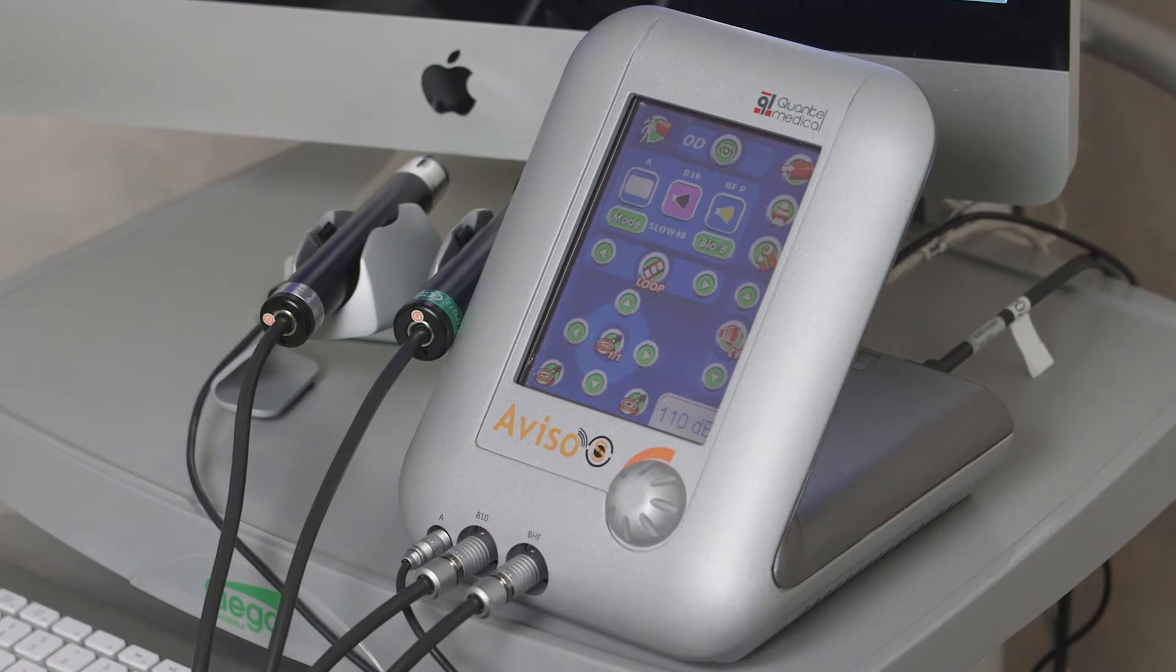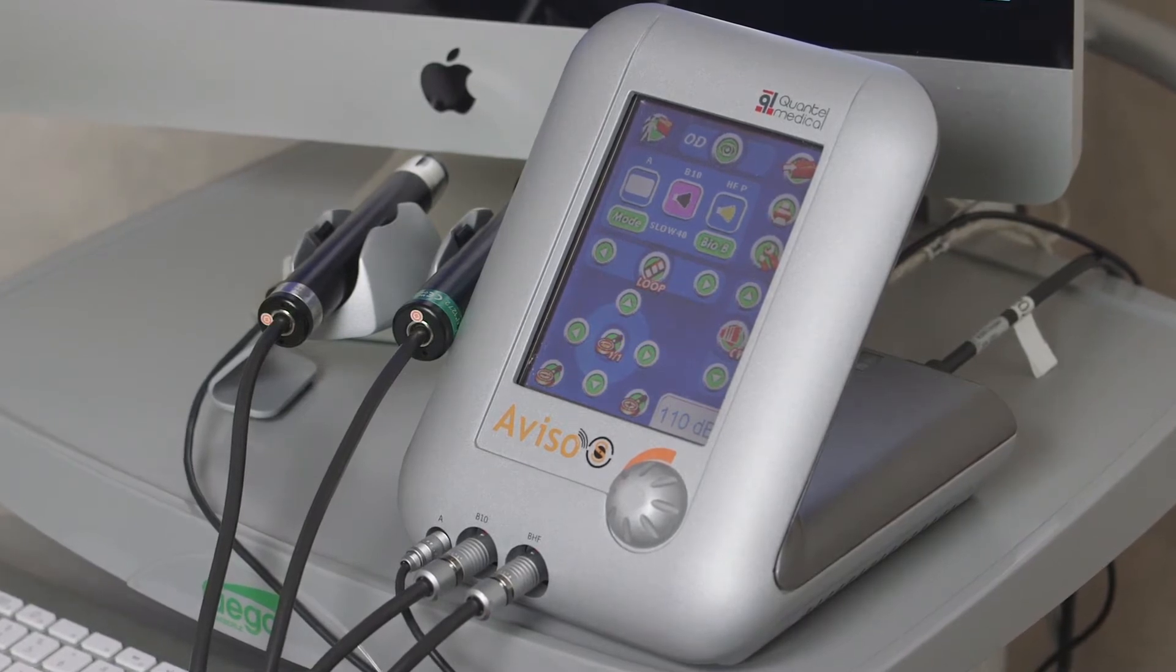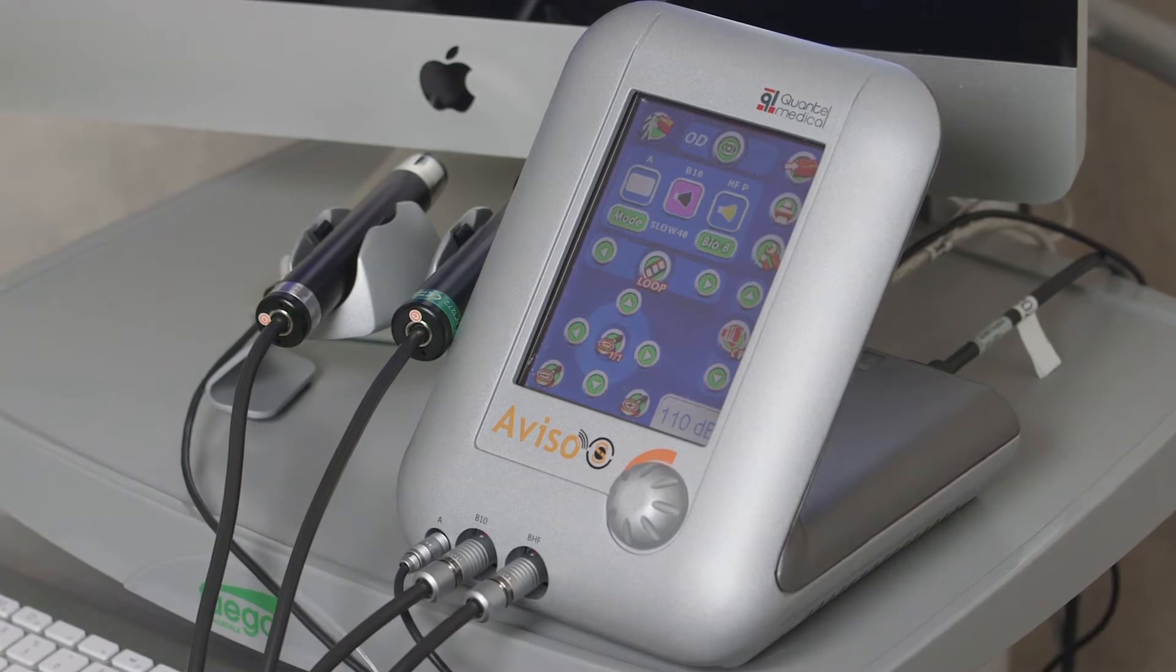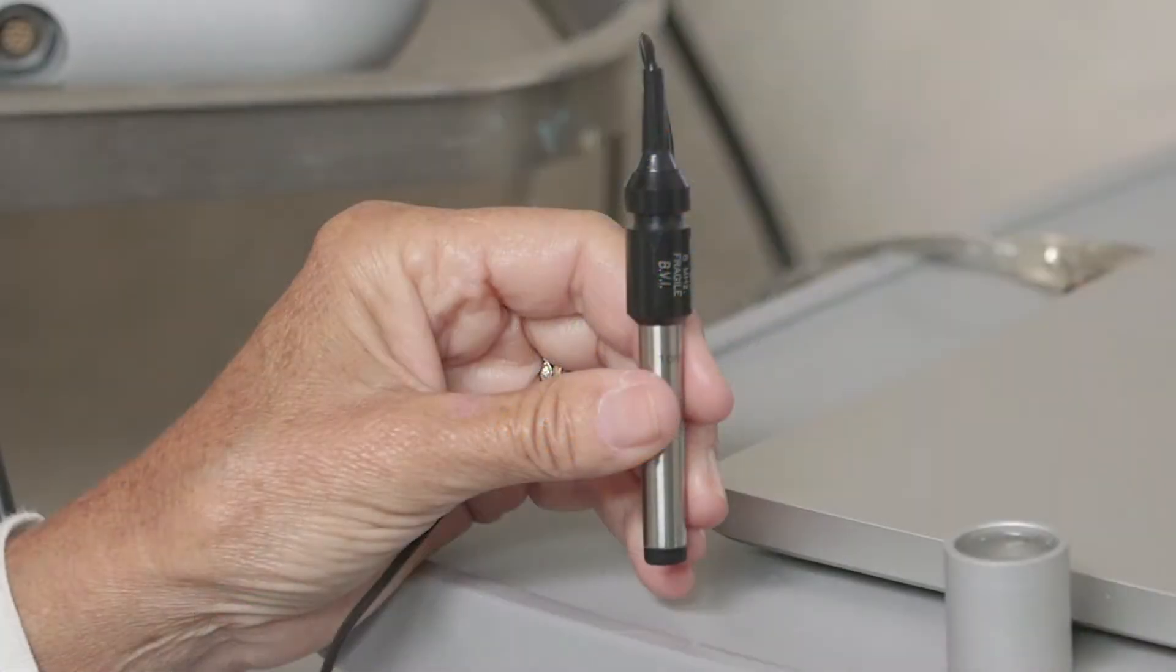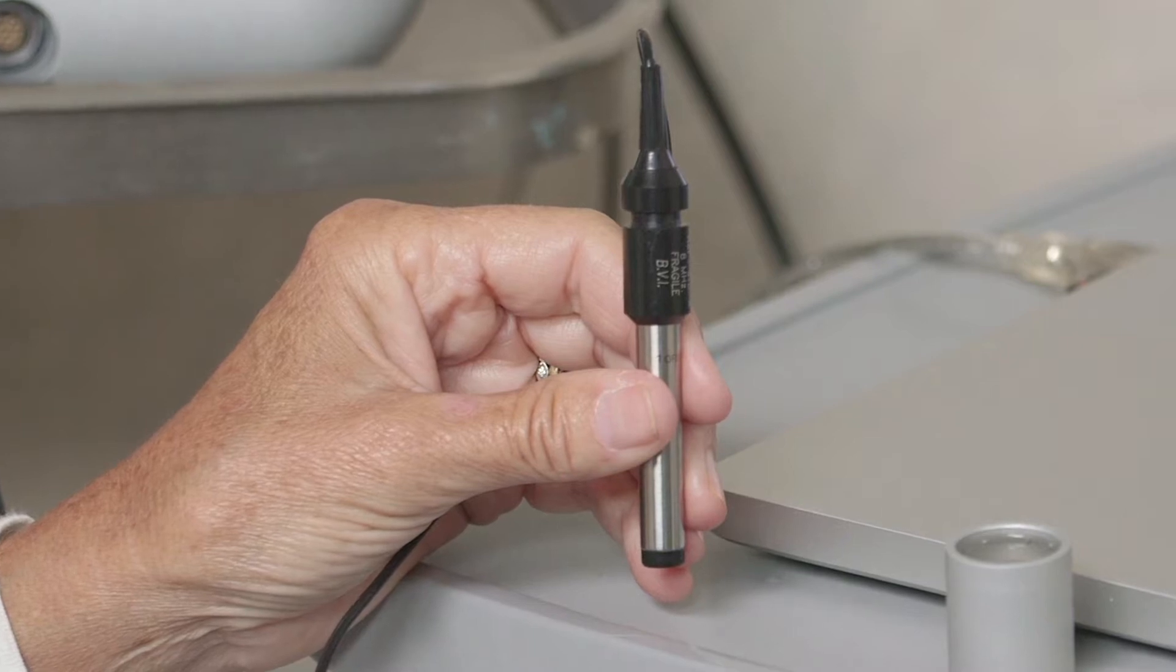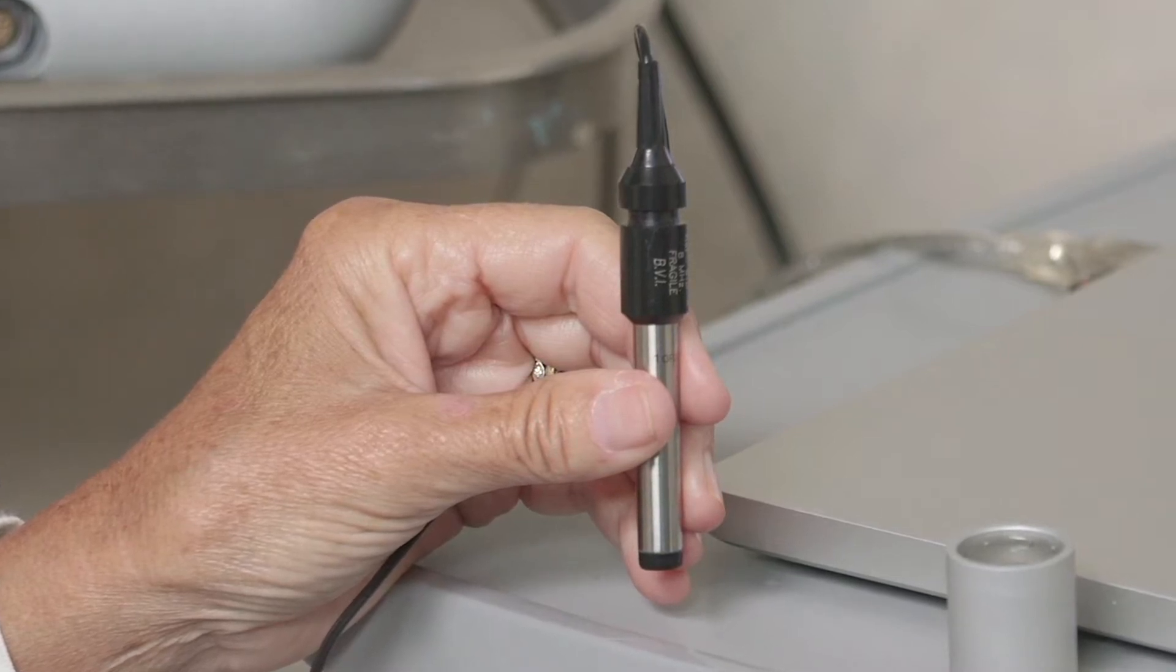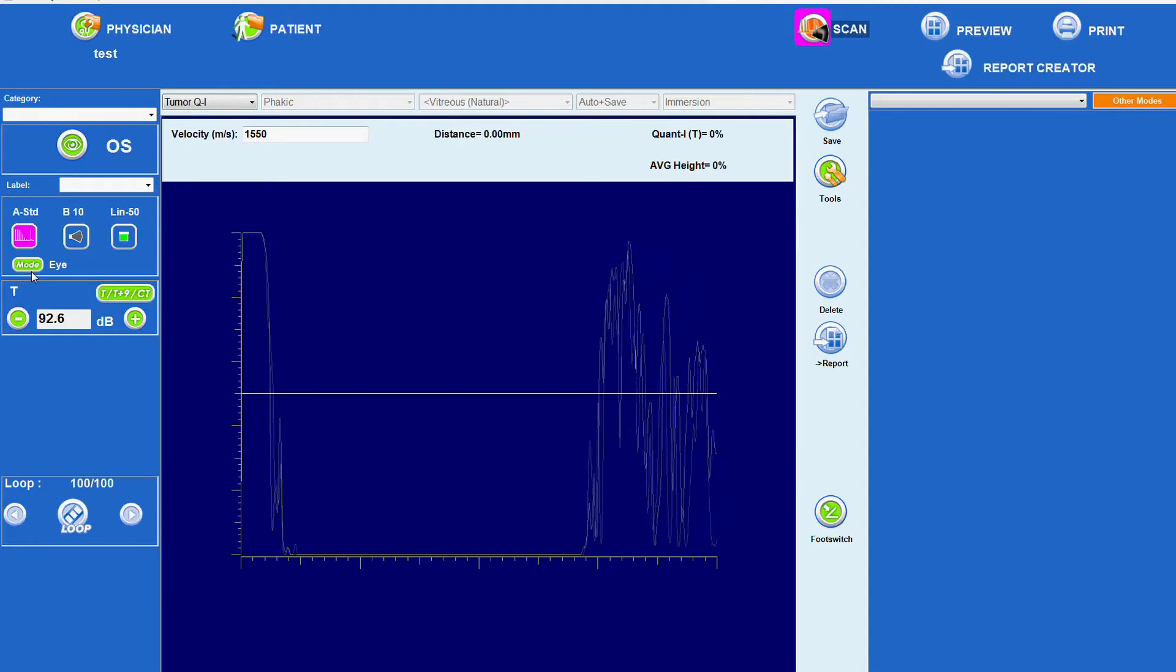Significant detail about tissues can be obtained using A-scan, amplitude modulation, which can add to the information obtained using B-scan, brightness modulation. The A-scan probe emits ultrasound energy at a frequency of 8 MHz in a parallel beam, that is a beam in which the energy level is uniform.